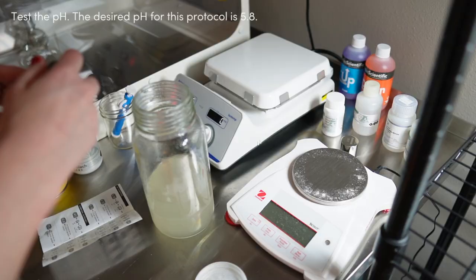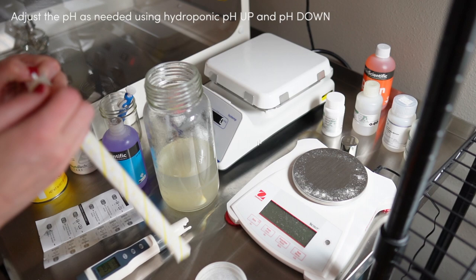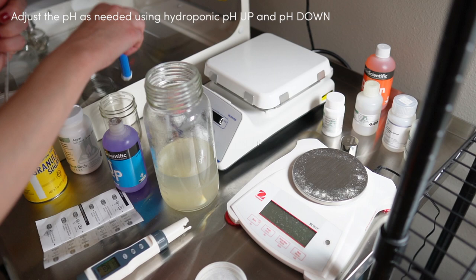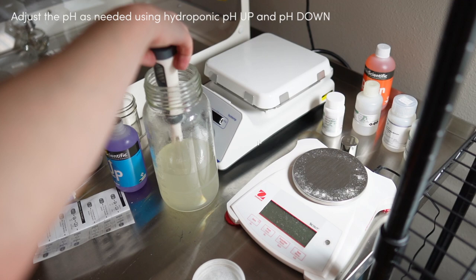So then I just fill the container up to the half a liter mark, or 500 milliliters, and I test the pH. I want it to be around 5.8 for this protocol. Every protocol will be a little different, but it's usually around 5.7 or 5.8 where you want the pH of the media to be. So mine was a little low, it was in the high fours. So what I'm doing here is just using basic hydroponic up to increase the pH of my media to get it to 5.8.